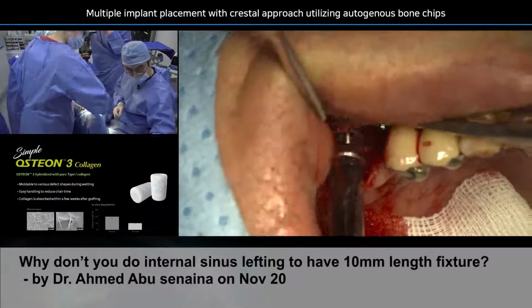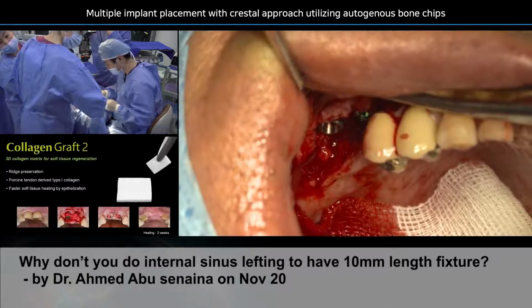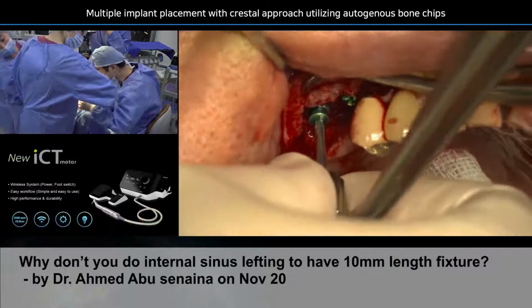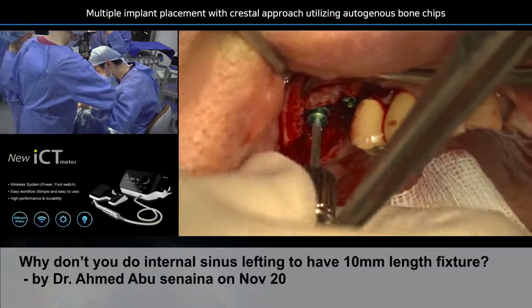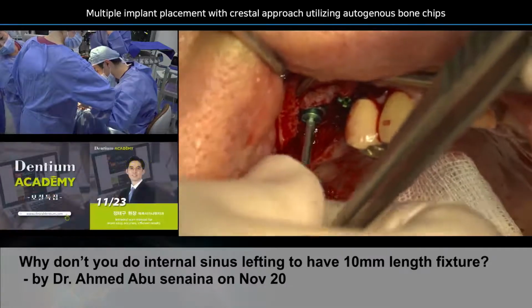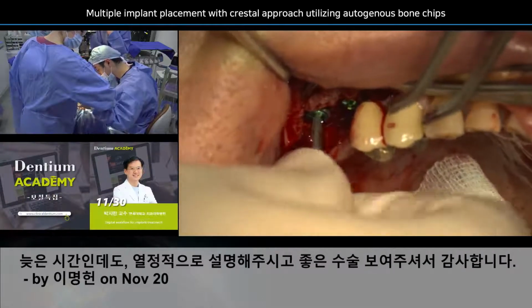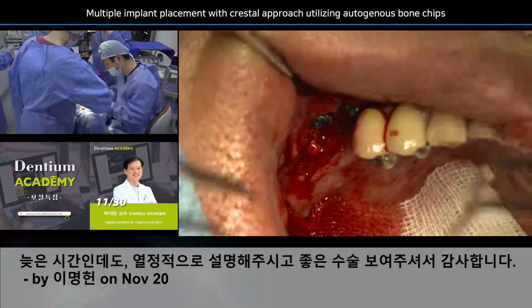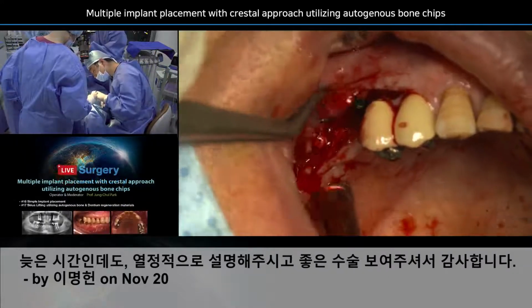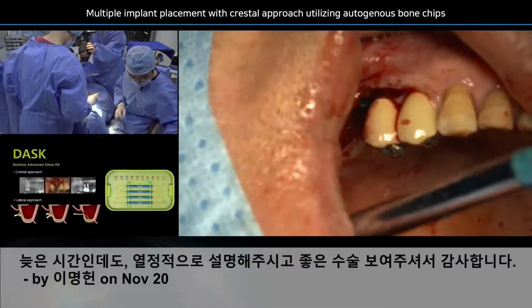Now the first cover screw is connected, and the second screw is again thumb and index and the middle finger. Your right hand goes in, and your left hand with the tissue plier applies pressure on top of the screwdriver, and then you just rotate the driver and the screw will find its way in. So this is how you manipulate the small instruments without dropping them. Now you can remove the gauze. So we have two implants placed, beautifully placed, and we have a huge defect. So we are ready for the bone graft.